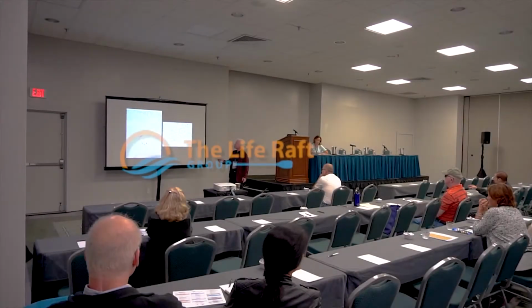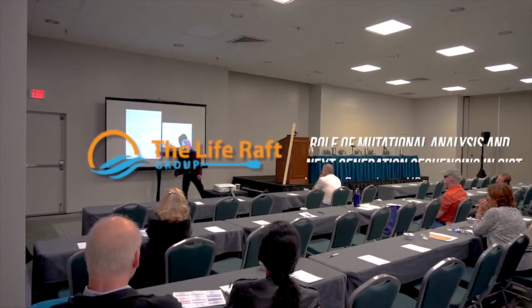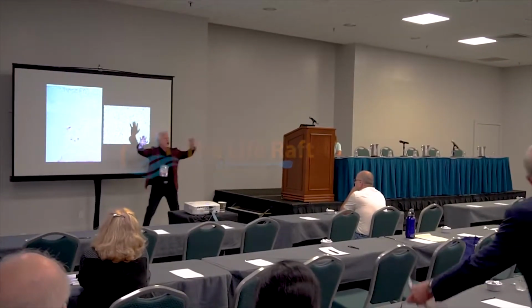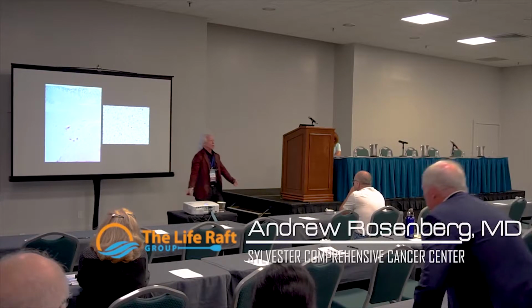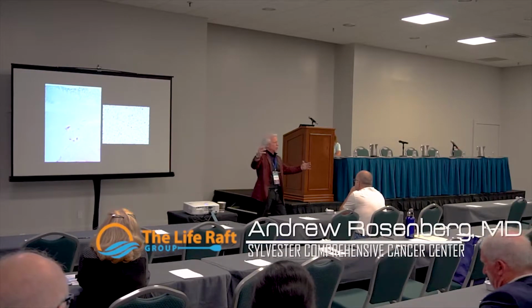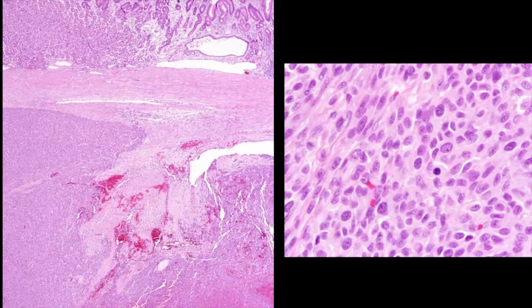We are looking at the gastric mucosa. This is what the tumor looks like at low power, a big solid mass. This is what the tumor cells look like at high power. Some are elongate, some are round. We need to identify what type of tumor that is.